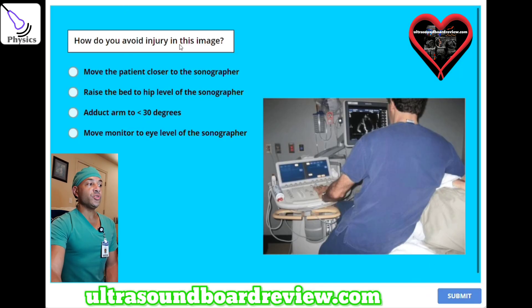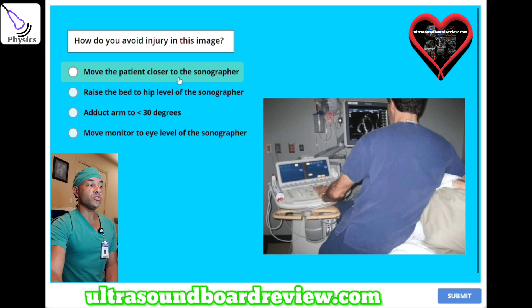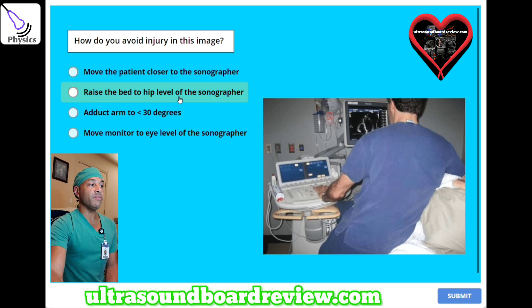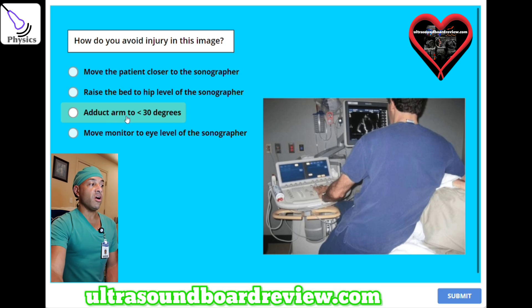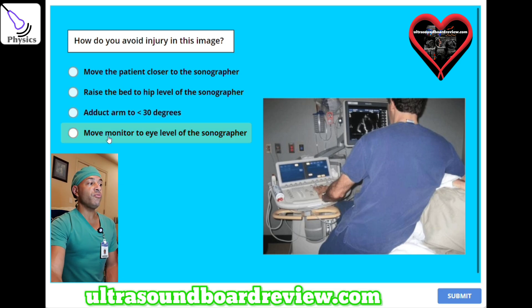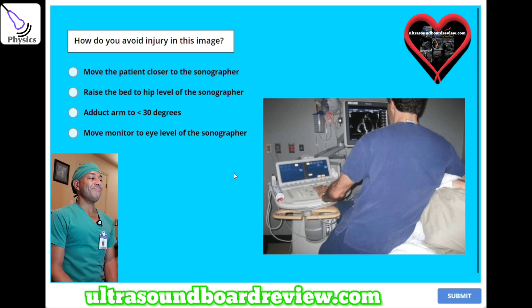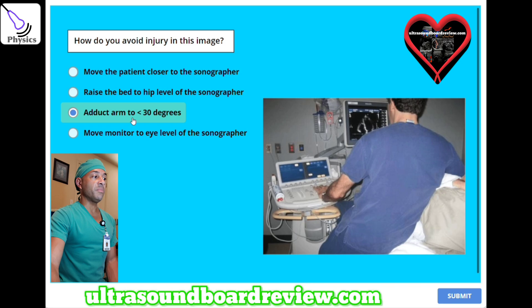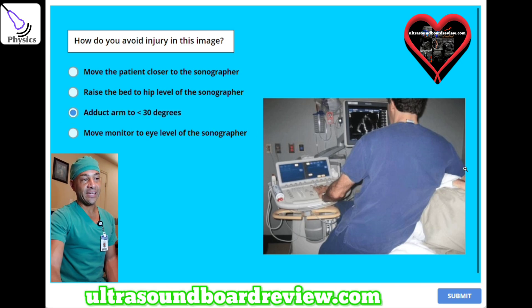How do you avoid injury in this image? A, move the patient closer to the sonographer. B, raise the bed to hip level of the sonographer. C, adduct arm to less than 30 degrees. Or D, move monitor to eye level of the sonographer. The answer is C — adduct arm to less than 30 degrees, because you can see the arm here is extended.